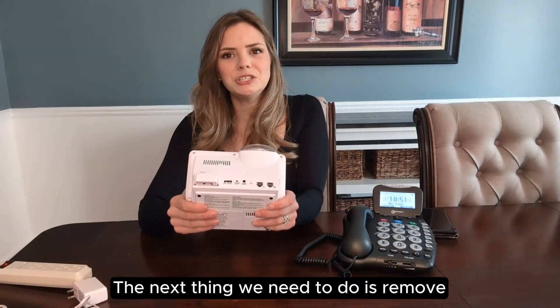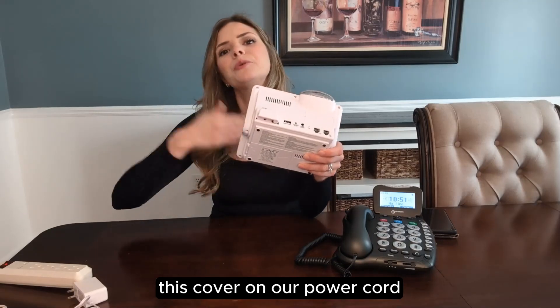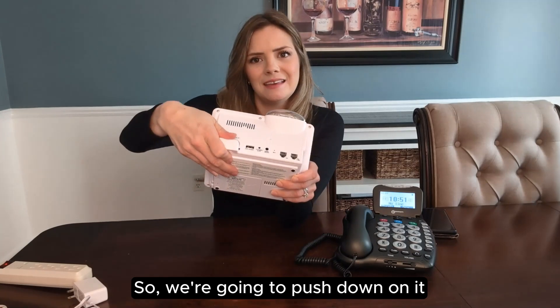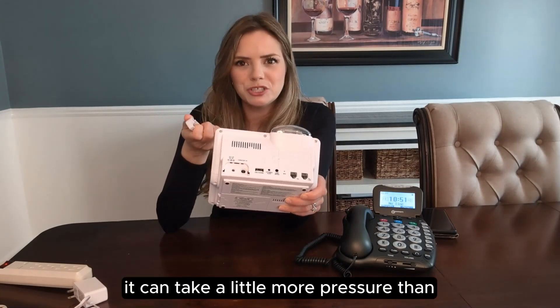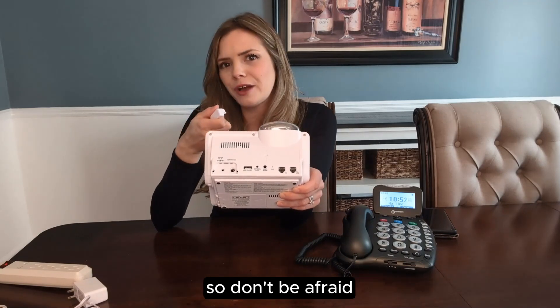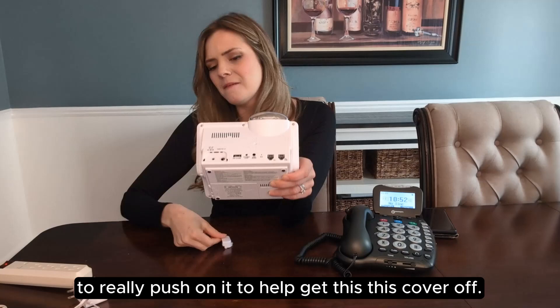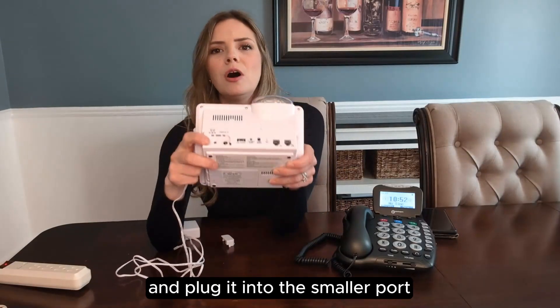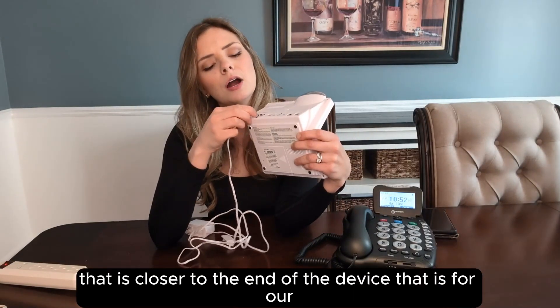The next thing we need to do is remove this cover on our power cord because we're going to plug the device into our outlet. Push down on it until it clicks right off. It can take a little more pressure than you think, so don't be afraid to really push on it to get this cover off. Then take your power cord and plug it into the smaller port that is closer to the end of the device — that is for power.